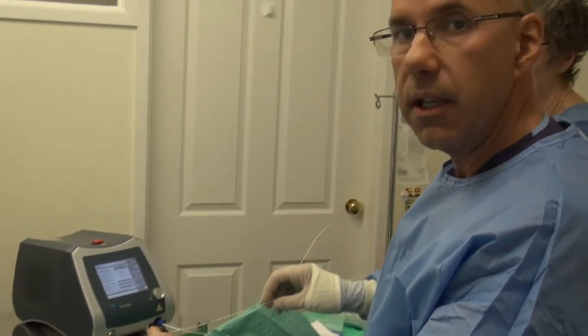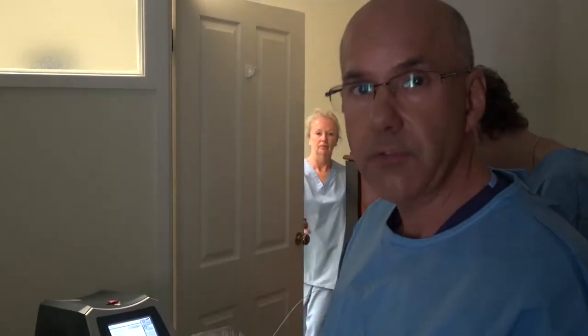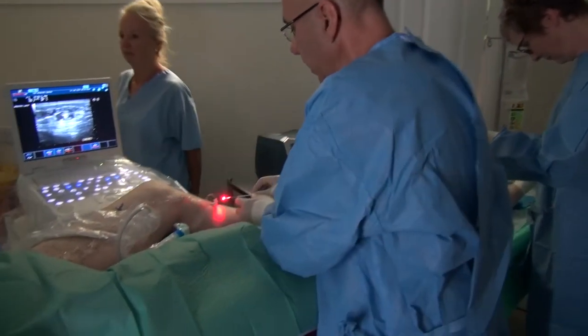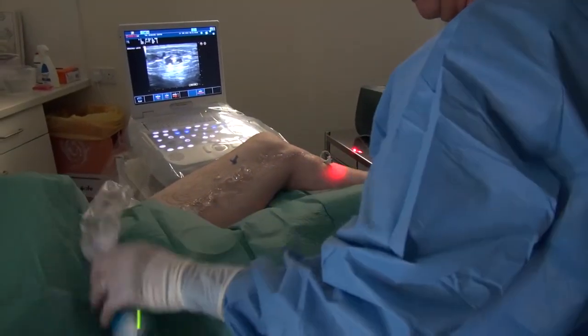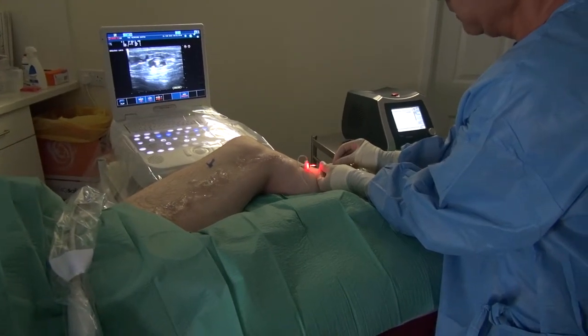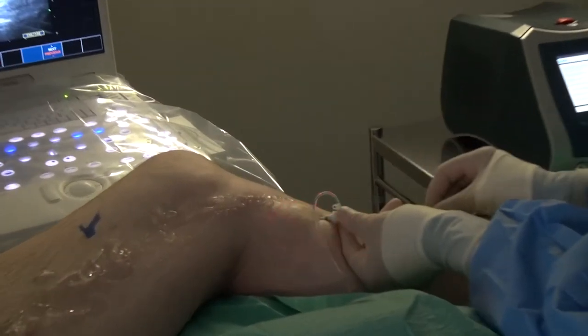I'm going to turn the light down a little bit and we'll be able to see the laser fibre with its aiming beam flashing, being introduced to the vein and being positioned at the top of the leg where the great saphenous vein joins the femoral vein. What I'm going to do next is introduce the catheter into the cannula. The cannula has been placed inside the vein.